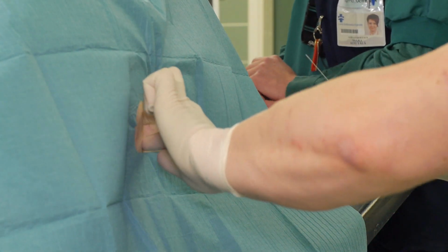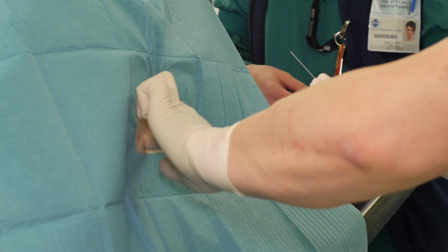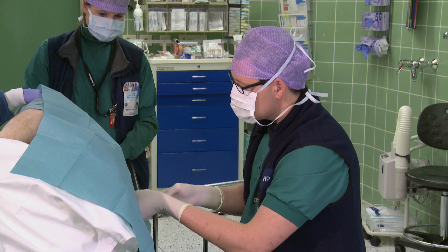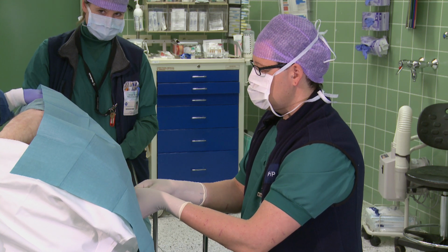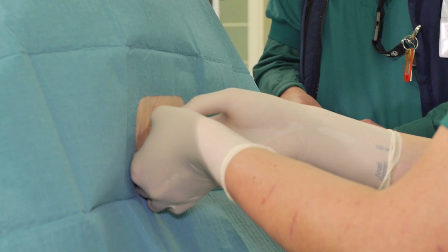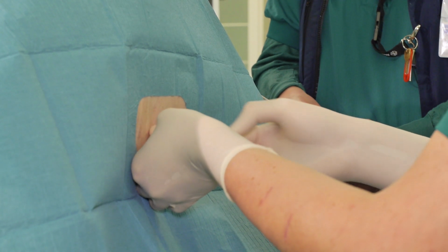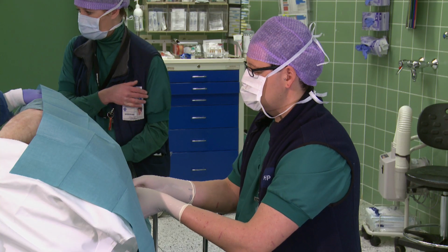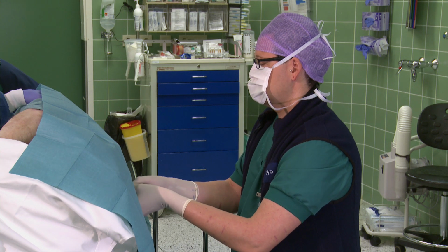The anaesthetist feels with his fingers the correct puncture site in the area between the third and fourth lumbar vertebrae. He asks the patient to draw their knees up to their chest and to stay totally motionless. The anaesthetist also warns the patient prior to introducing the needle, informing them it will feel sharp, and asks him or her to indicate if there are feelings similar to electric shocks in their legs. These feelings would indicate that the needle has hit a nerve.